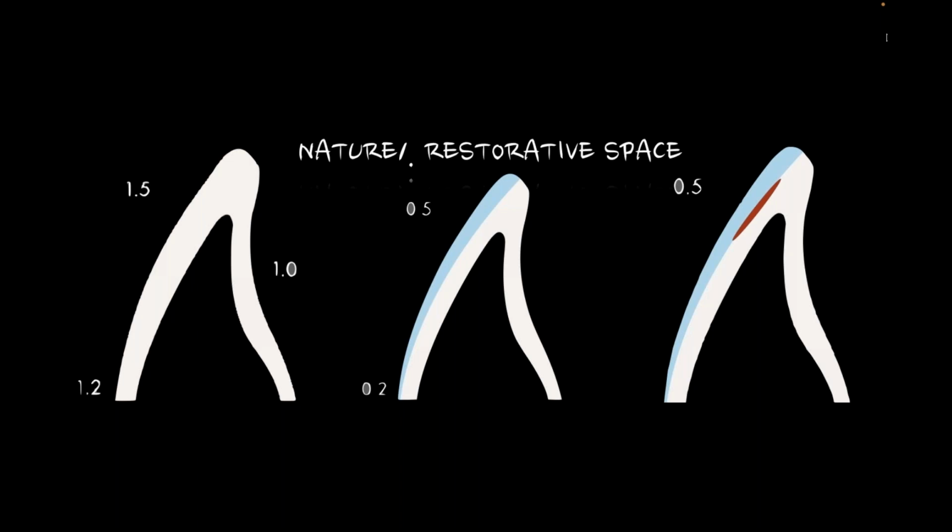So if we're in a veneer, as an example, as I'm designing a veneer, I know that I need 0.2 of a millimeter of enamel cervically up to about 0.5 of a millimeter of enamel towards the incisal edge. By the way, this is standard for almost any layering concept. If I'm building a thimble coping and layering opacious dentins and 90 different powders, in the end, after I've layered those 90 powders, I want 0.5 of a millimeter of some sort of translucency. What that translucency is, I'm purposely being a little vague at this moment, but I know I need to finish it with some sort of translucency.